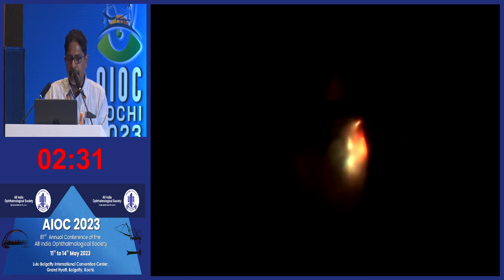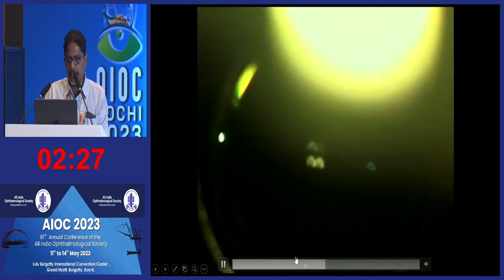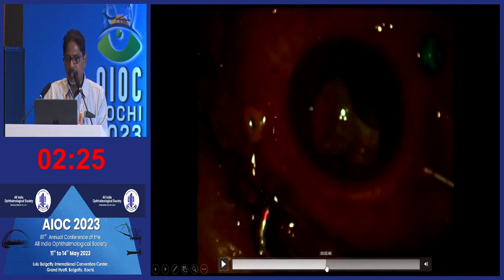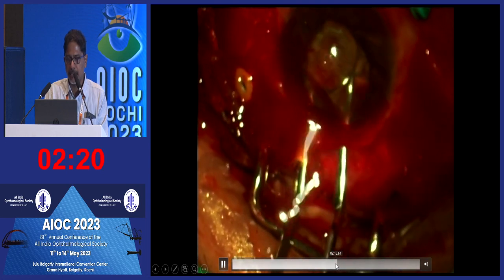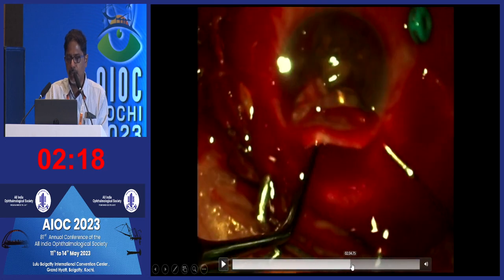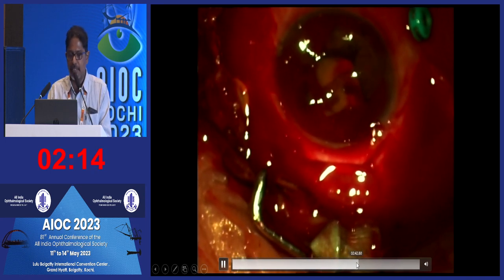You can see that now I have grasped the air gun pellet and I'm trying to remove it through the superficial scleral tunnel here. You can see now it is coming out. Using the McPherson forceps, I'm grasping the air gun pellet and removing it. The advantage of putting oil in these cases is that it prevents bleeding from mixing into the vitreous.